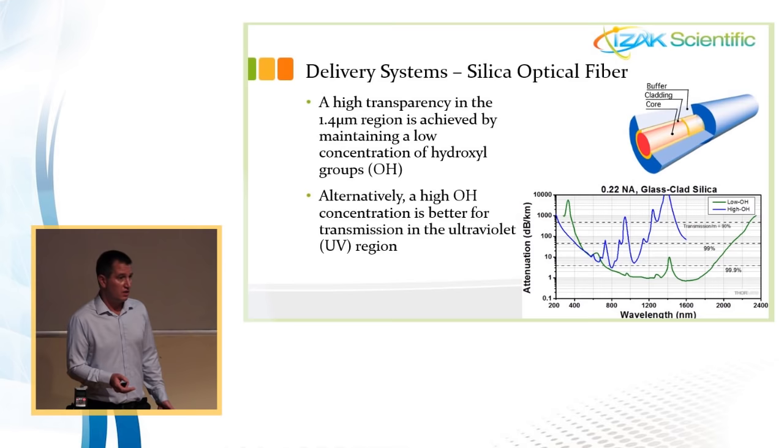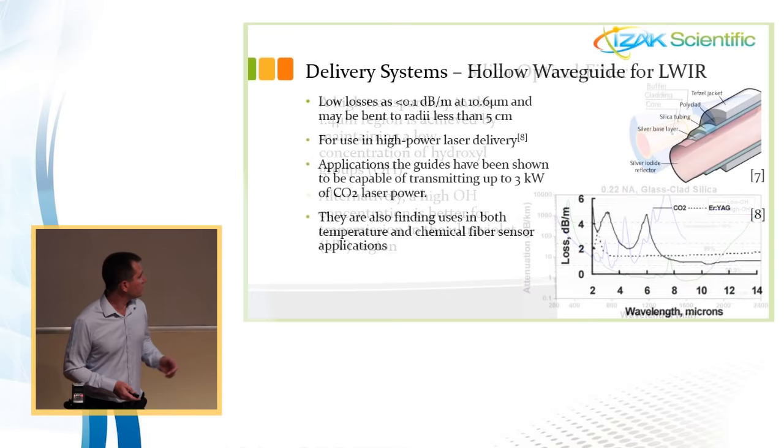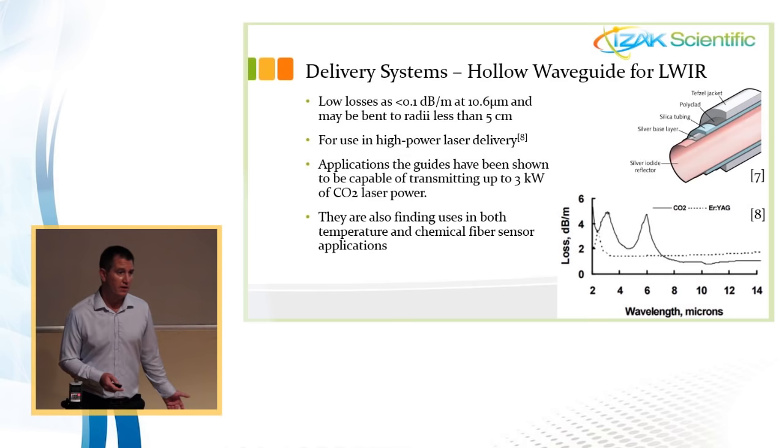as an incision tool. So until about 10 years ago, there was no solution for it. There was not actually a flexible solution for it. But in the last 10 years, or the last 6-7 years, a waveguide was developed. The waveguide is different from the optical fiber.